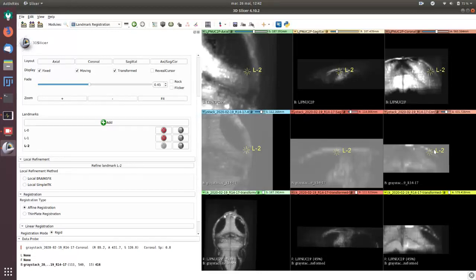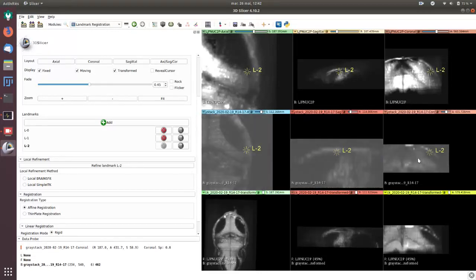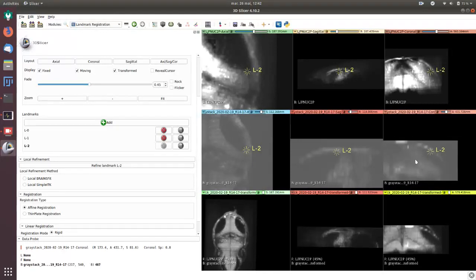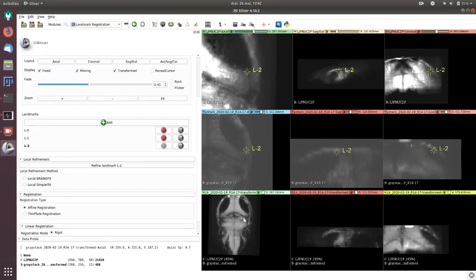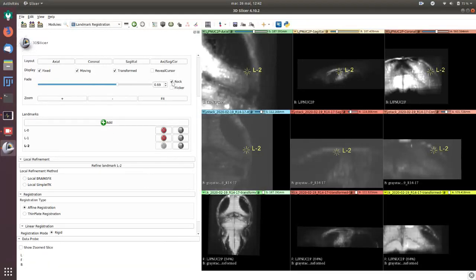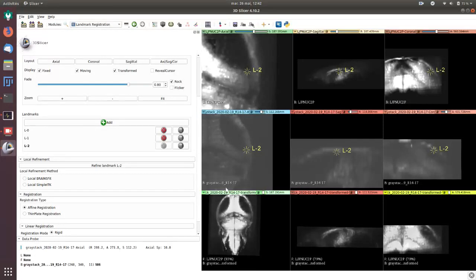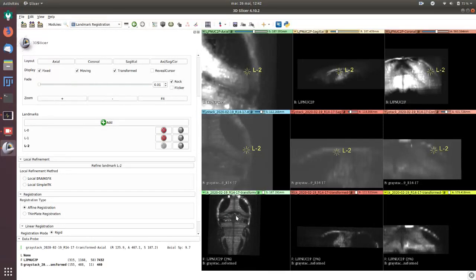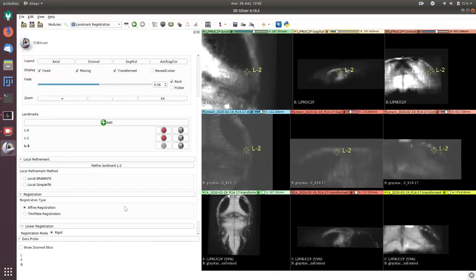Make sure on the free views that it corresponds well. You can adjust the contrast at any time, you can zoom in, pan. Once you're okay with the results you can check it by a rock, for example, which allows you to move smoothly from one to the other.